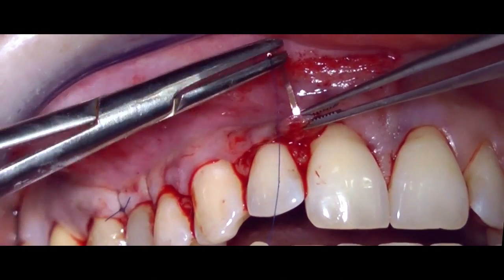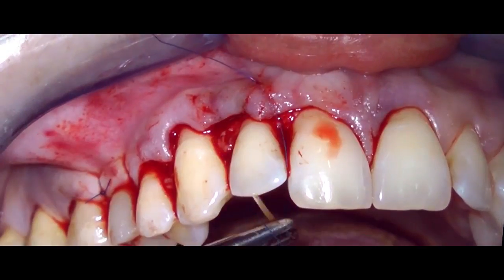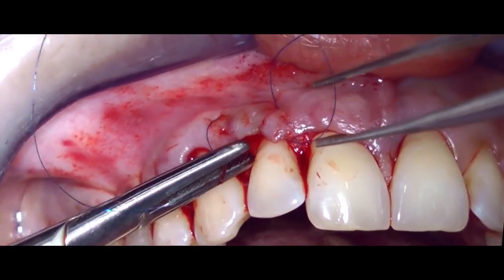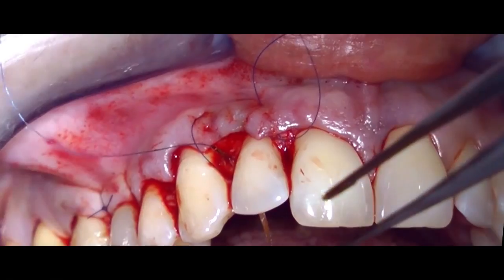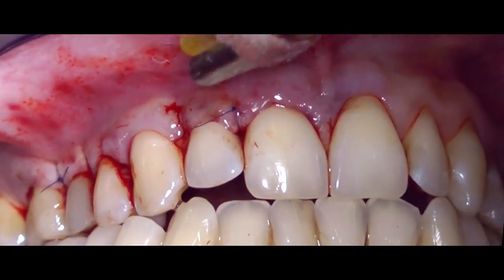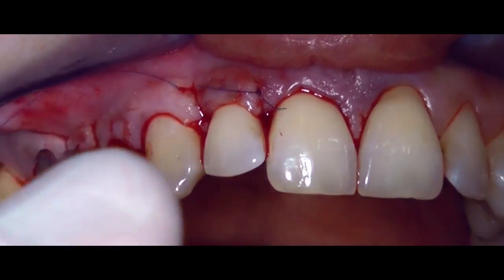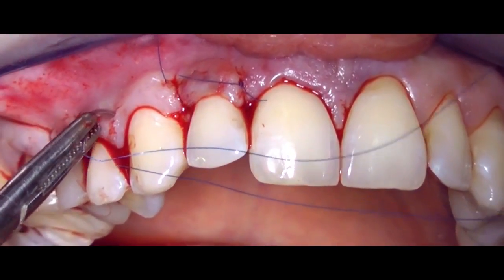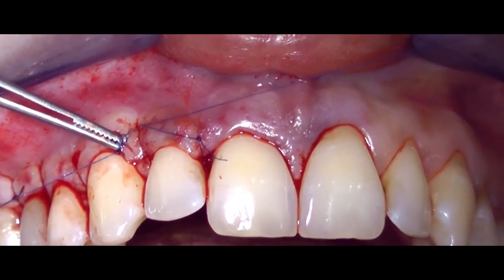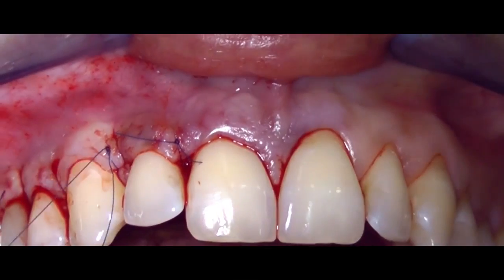The next area to be sutured is the mesial area, and we will be alternating between distal and mesial areas until the final sutures on the central area, which is the area that undergoes the greatest advancement. This suturing technique allows for an interesting adaptation of the marginal tissue to the root recession, allowing for clot stabilization.